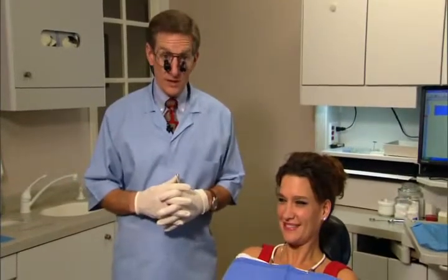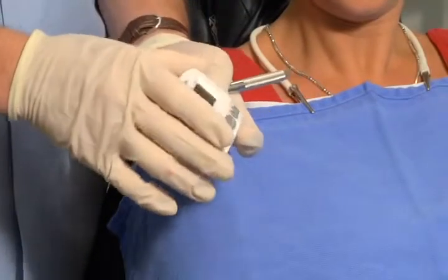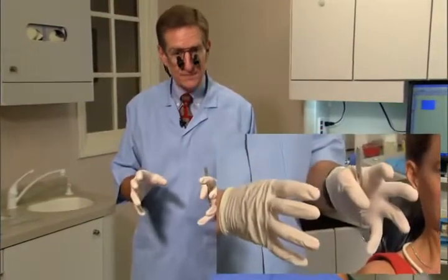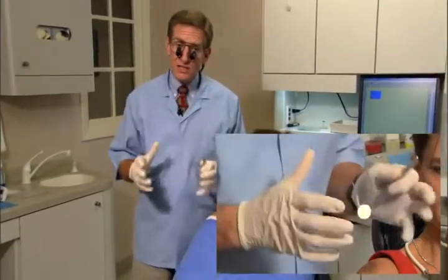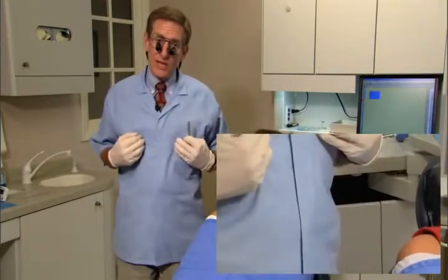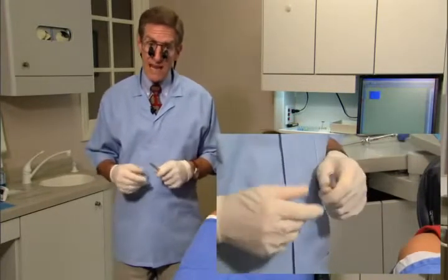While she's mixing, let's talk about step four. We know it takes 3 minutes 30 seconds for alginate to set — set a timer. Kathy has incorporated the liquid and powder and set the timer at 3:30. As it sets, you can verify that it is set. Most people check by digging a thumbnail in, but with a timer everybody knows exactly when it's done — that tells the patient you know your stuff. That's called added value dentistry.